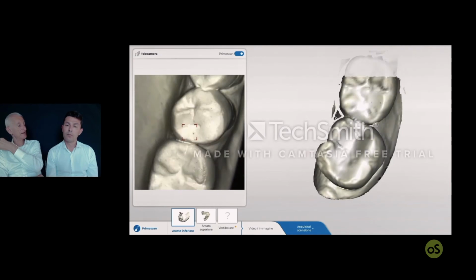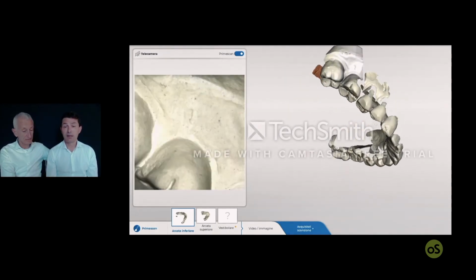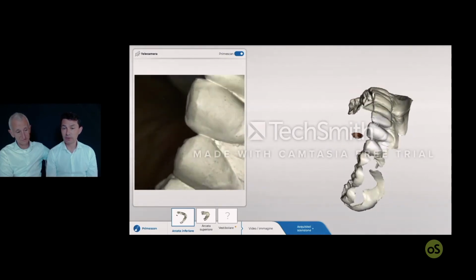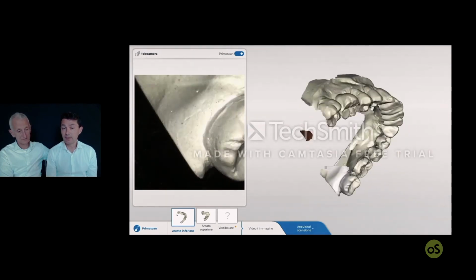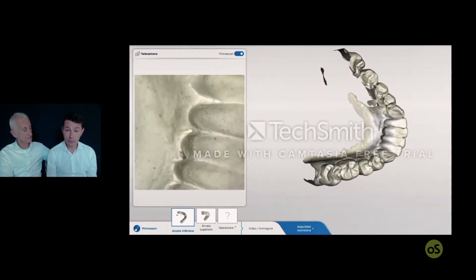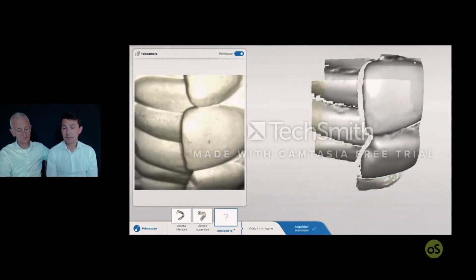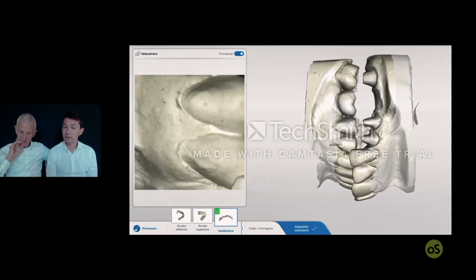So you prefer to have a physical model? I think it's a good option because the acquisition is very easy now, and you cut the trimming and shaping time. I think you cut a couple of hours to make the restoration.